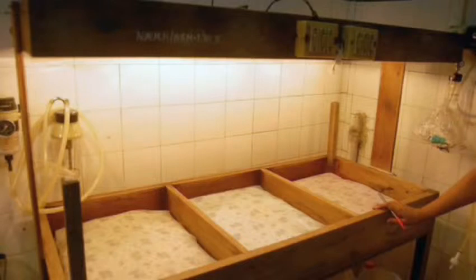But traditional incubators require electricity and cost up to $20,000, so you're not going to find them in rural areas of developing countries. As a result, parents resort to local solutions like tying hot water bottles around their babies' bodies or placing them under light bulbs like the ones you see here, methods that are both ineffective and unsafe. I've seen this firsthand over and over again.